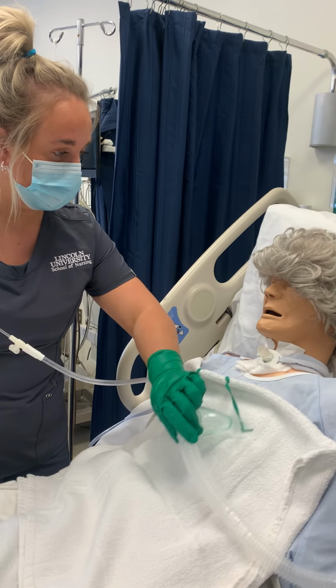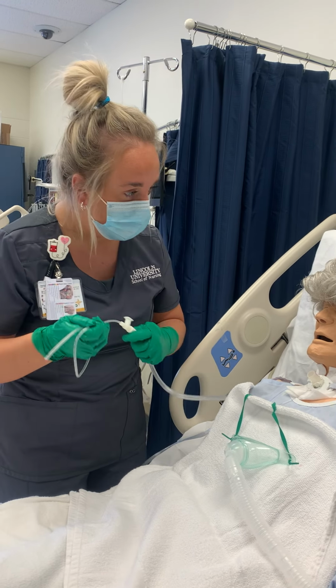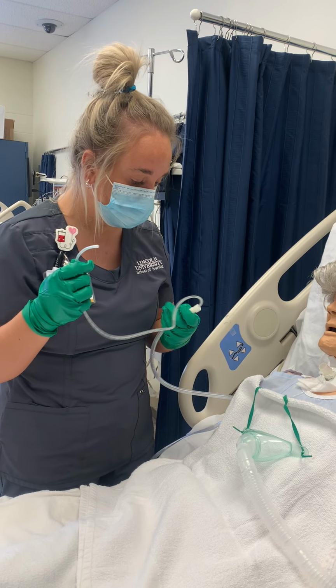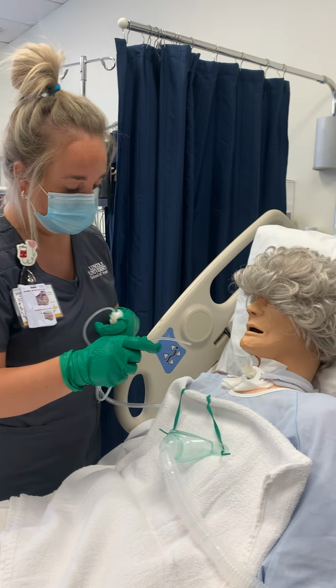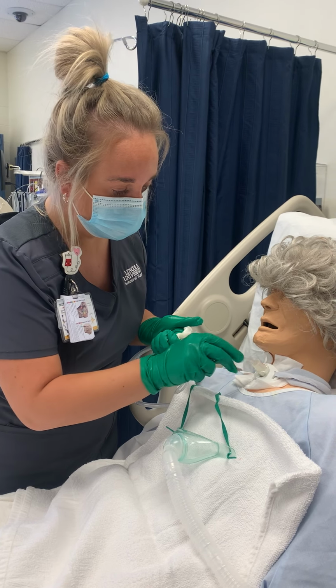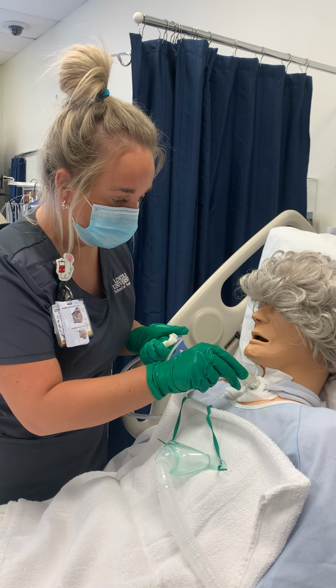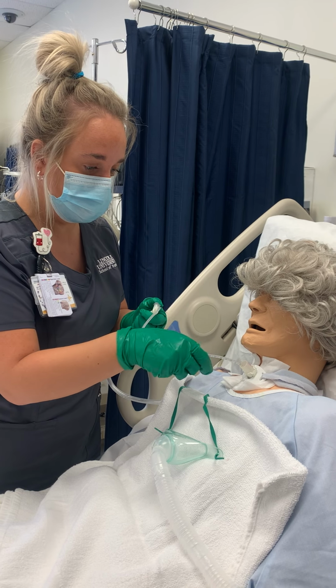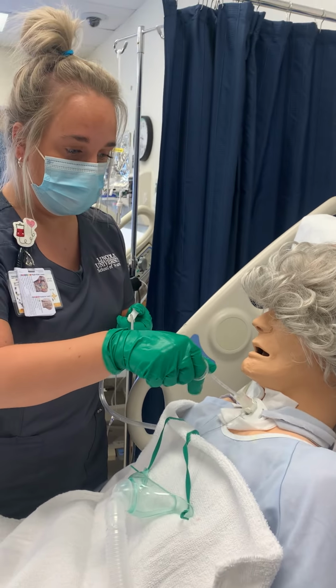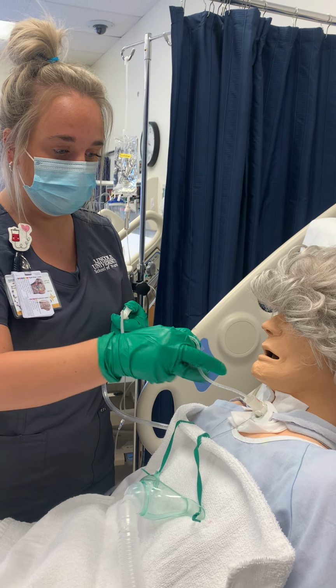All right, Mrs. Smith, we're going to go ahead and suction you, okay? Like I said, if you need a break or you're having any pain, just go ahead and raise a hand for me, all right? Okay. All right, so I'm gonna go until I meet resistance. Okay, and I'm gonna do continuous. Making sure I have control.